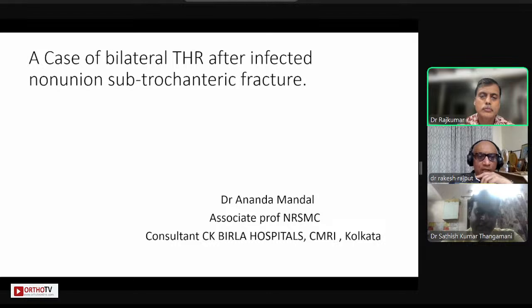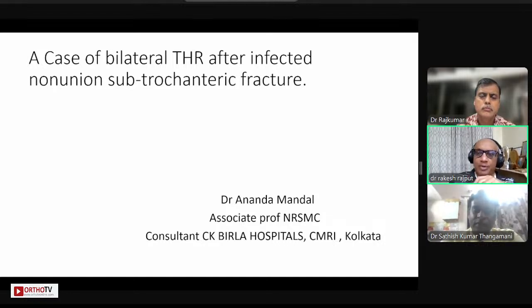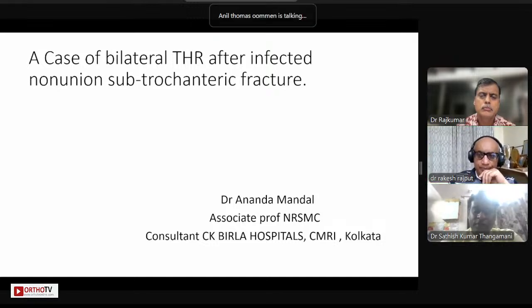So Anil, Rajkumar, and maybe Satish, all the guys who are working with this stem, it always looks very flimsy to me, very small and thin. How good is it in the long term? And does this stem bend or break? No. You're talking about the cemented one, Rakesh. Yeah. Like I said, my choice, I would put in a Wagner, Rakesh. I wouldn't do a cemented one.